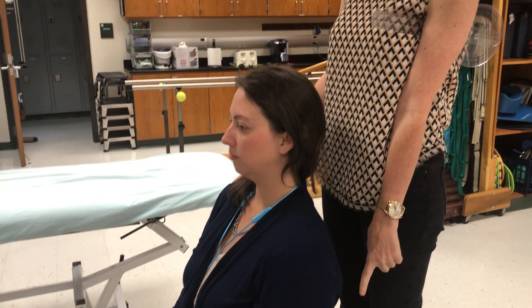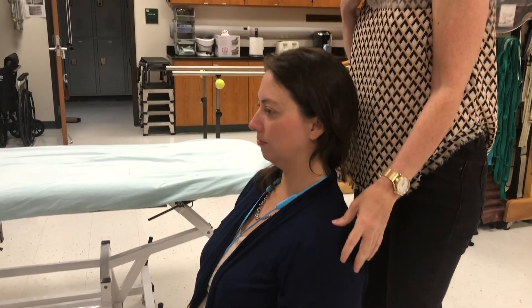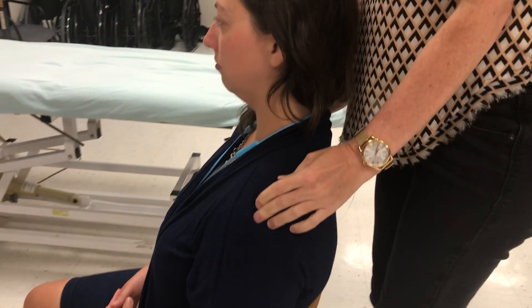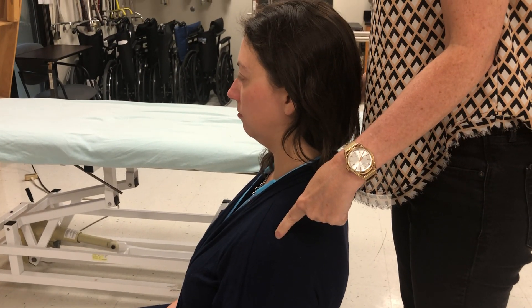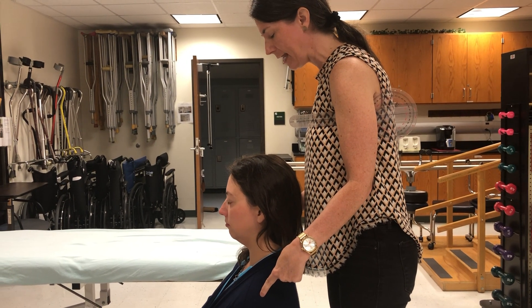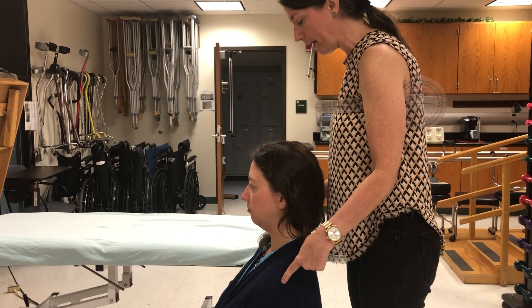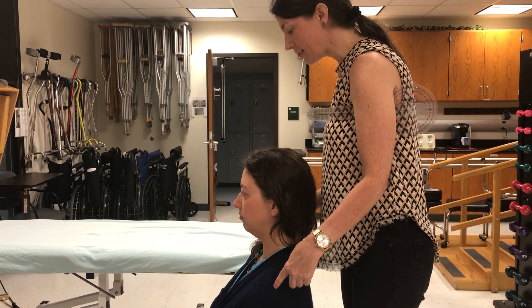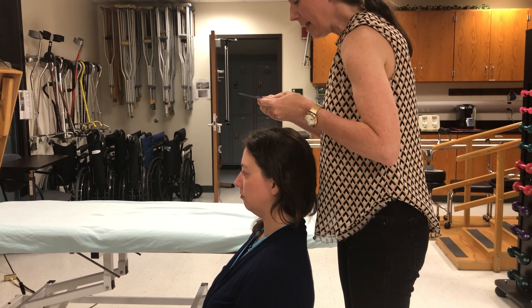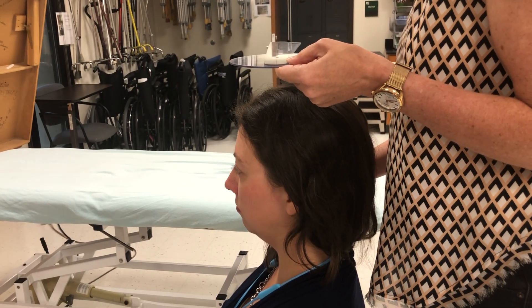I've placed the legs of the chair along one of the black lines in the floor to help me. I'm going to palpate the acromion processes — first I palpate the spine of the scapulas and come around until I turn that corner a bit. Now I'm on the lateral edge of both acromion processes and I'm looking straight down imagining an imaginary line that connects my fingers. I use a little hack where I compare this line between my two fingers with the lines on the floor — most of the time they are parallel, and sometimes they're off a little bit. That just means when I set up my stationary arm, it needs to be parallel to the black line on the floor, or have the same relationship that my original acromial line had.